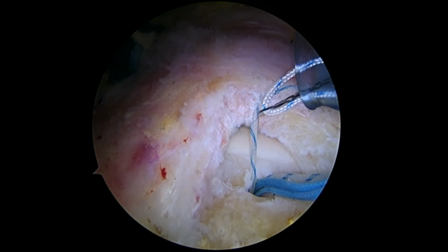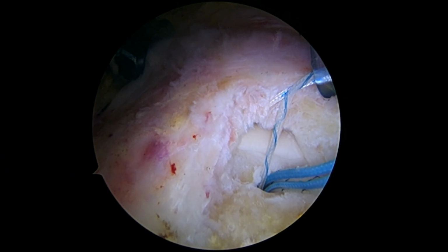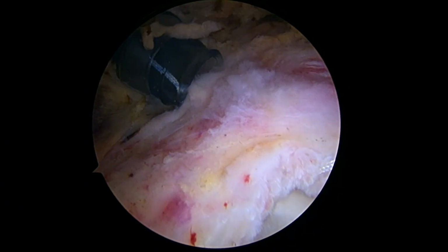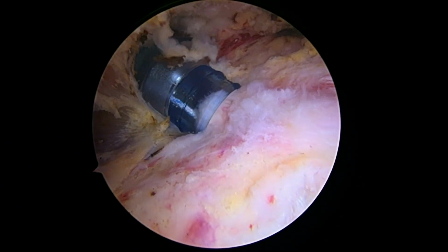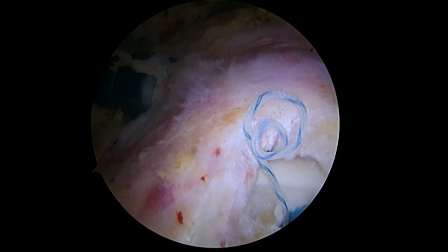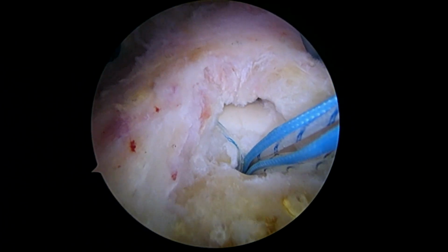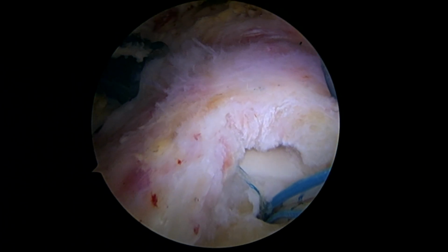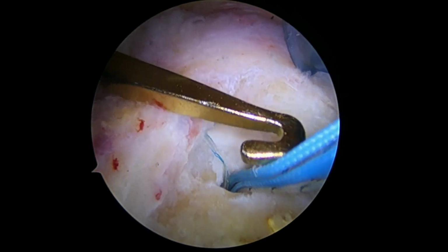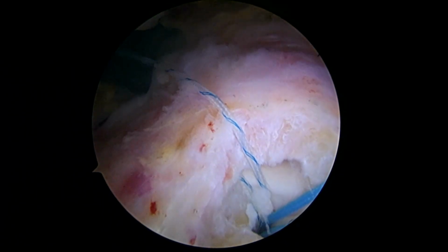So there, as we go slowly, you see how it captures that suture there, and then we just keep pulling. Next we'll use a turn to the right. And so, a grasper please. So now the blue and white suture is coming out the back here. We'll just get the rest of it and keep pulling. And then we'll take a crochet hook, get the partner suture, and now we've got those two out of the way, so that's great.